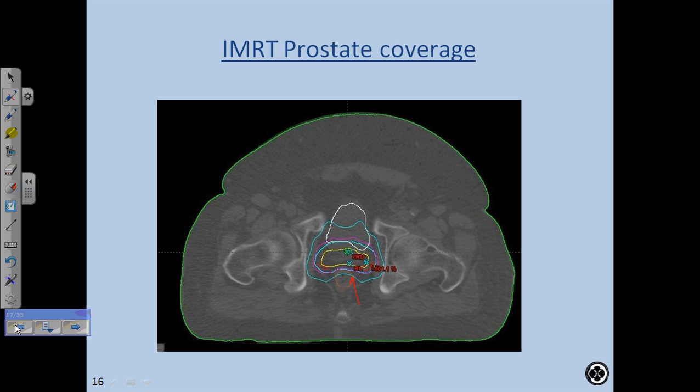Traditional 3D treatment planning, back in the old days, was a box, because we just had blocks. Then when we started doing 3D, we got a little more sophisticated, and with 3D treatment planning we could get isodose distributions that looked more oval, like that. But not like this. That's only IMRT. So that's the biggest difference: you can shape your isodoses around structures. So, inverse treatment planning, structures.